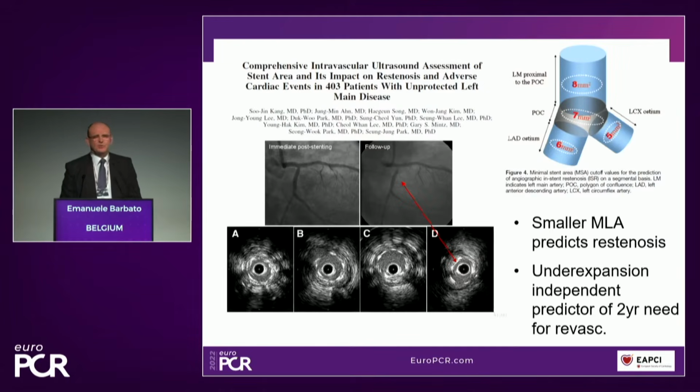And actually, we've known what to do with intravascular ultrasound for a long time. This data from Kang goes back 15 years. And we know that if you don't get a good result, particularly at the ostium of the circumflex, that the patient outcome will be poor.